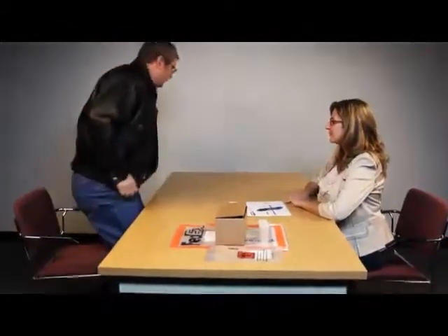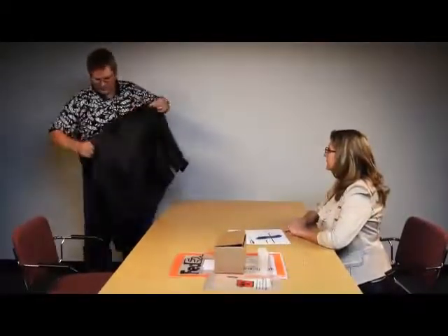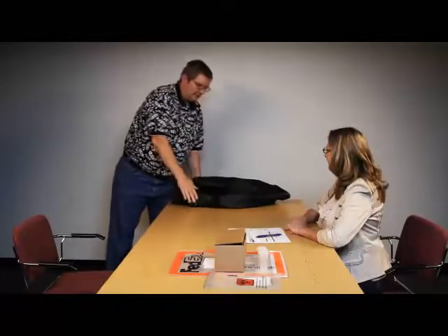Please stand and remove your jacket. Okay. The collector must ask the donor to remove any unnecessary outer clothing, such as a jacket or hat, and have them leave any bags or briefcases with them. The collector must make sure that these personal items are secured during the testing process. The collector is required to provide a receipt to the donor if requested.